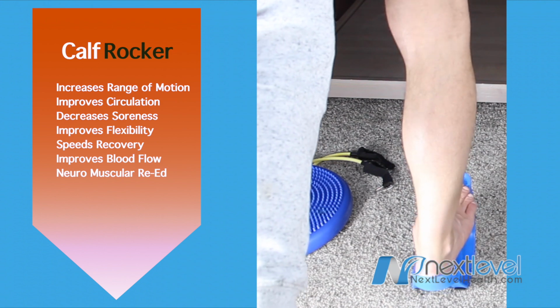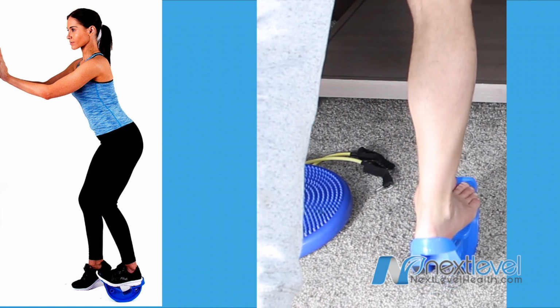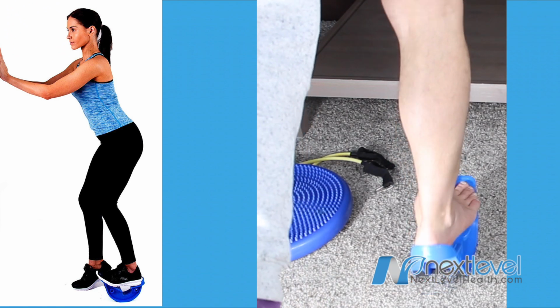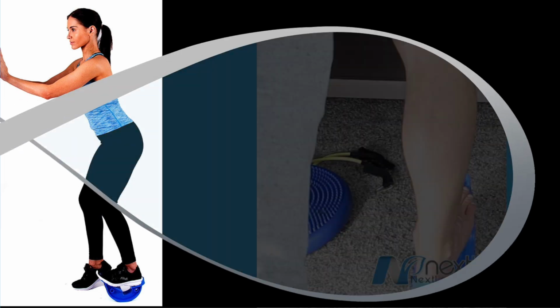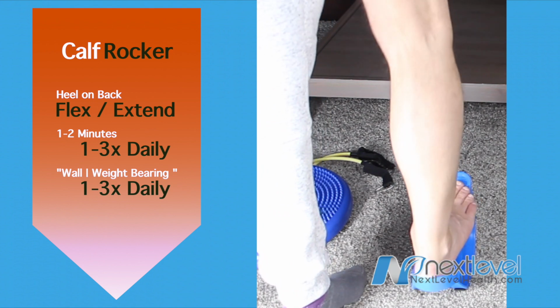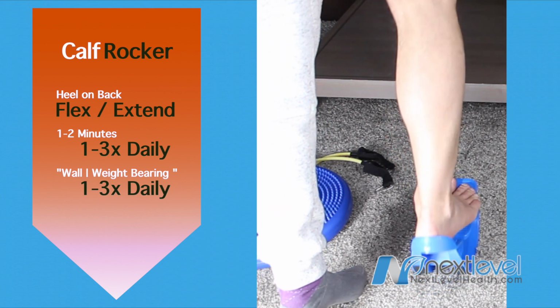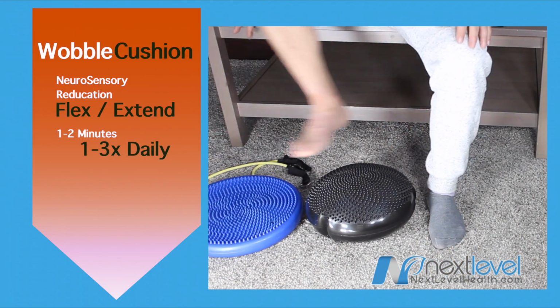You may also want to place this against a wall as you're leaning against a wall, and then you can put more pressure. I actually like to stand on this one side foot, but brace yourself. I would suggest doing the calf rocker 1 to 2 minutes, and you can do that maybe even a couple times a day. So maybe 1 to 2 minutes, a couple times a day.